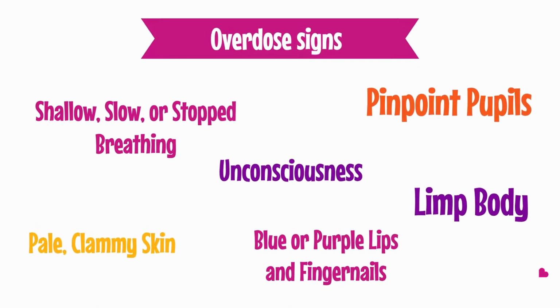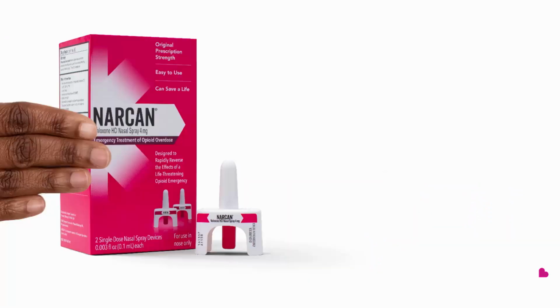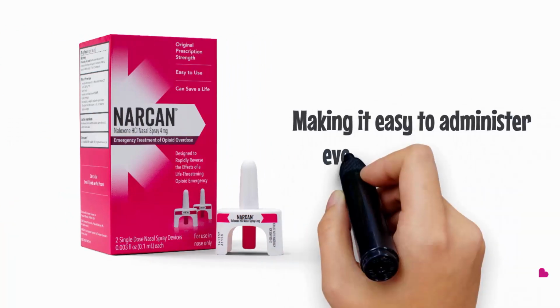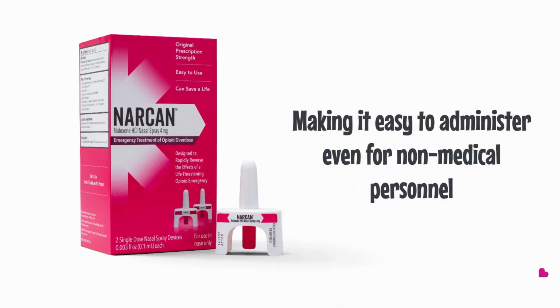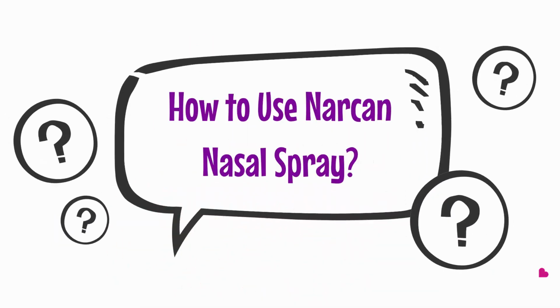If you suspect someone is having an overdose, you need to act fast. Narcan can quickly reverse the effects of an opioid overdose. It's available as a nasal spray, making it easy to use, even for non-medical personnel. How to use Narcan nasal spray.